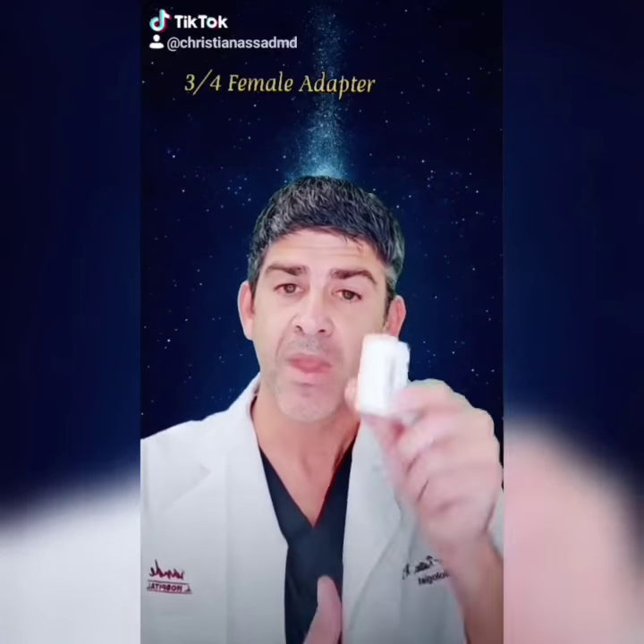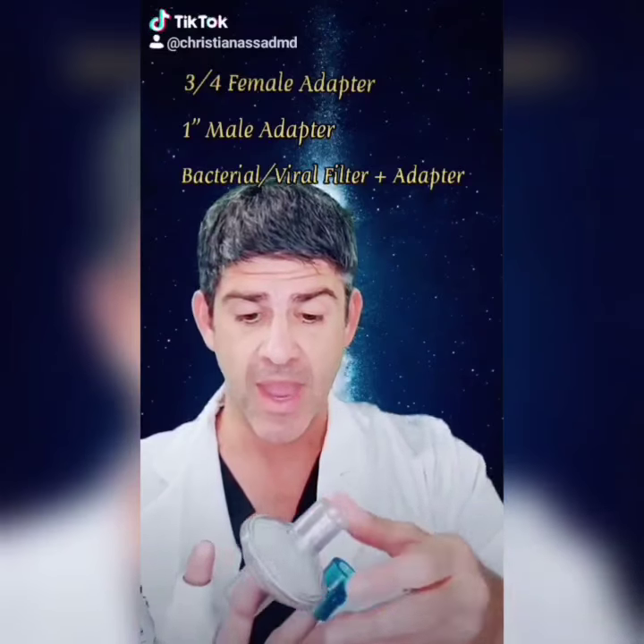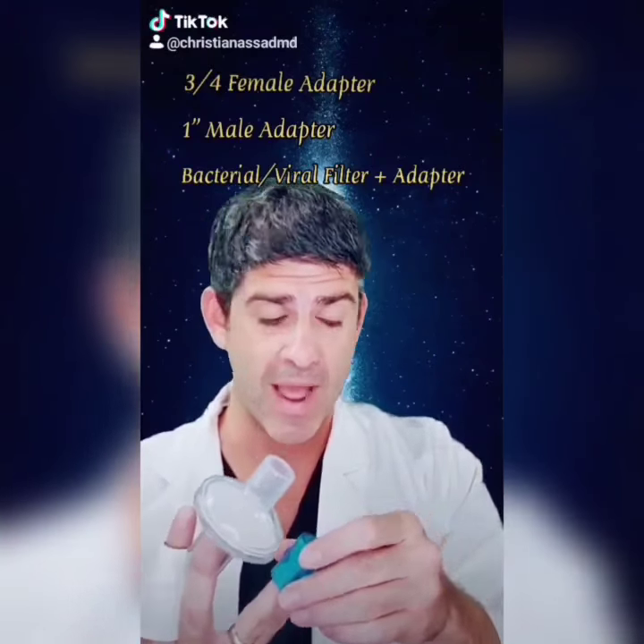By going to Home Depot: a 3/4-inch female adapter, a 1-inch male adapter, your viral bacterial filter, and the adapter for that.